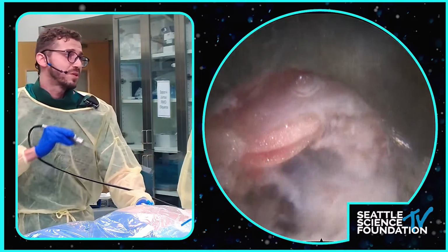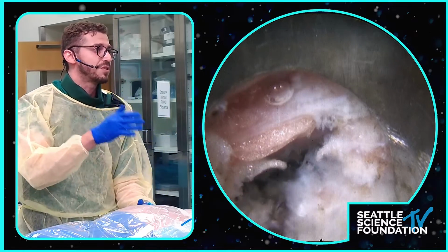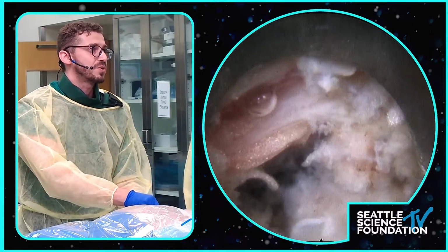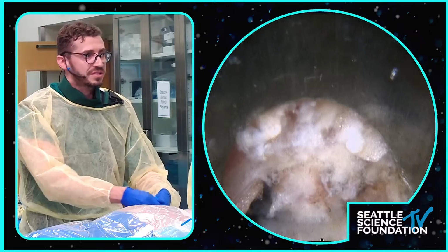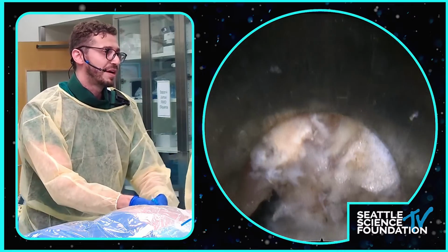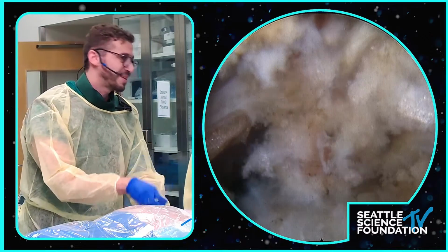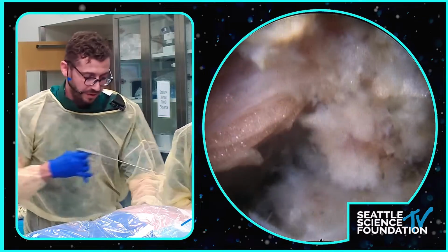So going back to the question about the interlaminar versus transforaminal, for me, anything from 1 to 5, I like to do transforaminal, unless there's also some ligamentous hypertrophy causing some lateral recess stenosis. In that situation, you could definitely do it transforaminal, but in my hands, I feel like interlaminar is better. And obviously, 5-1, I usually like to do interlaminar as well, even in patients, the Kerrison please, even in patients that maybe their anatomy is amenable to a transforaminal approach.